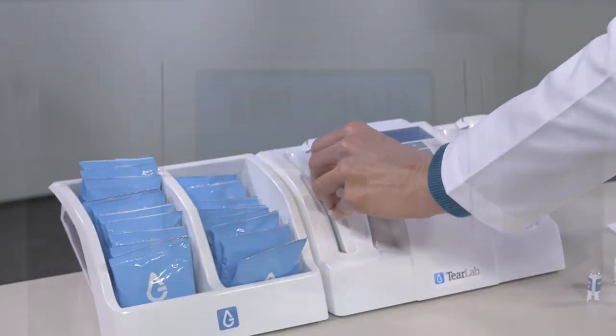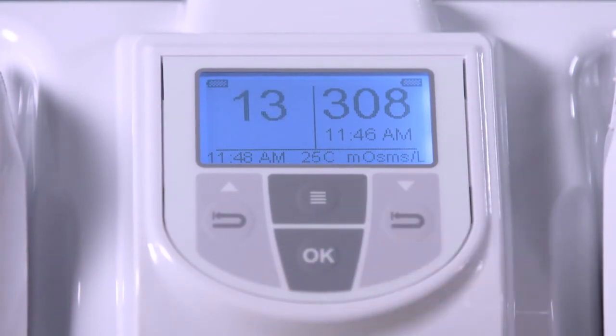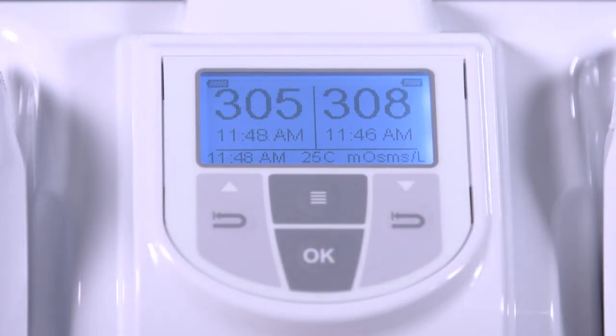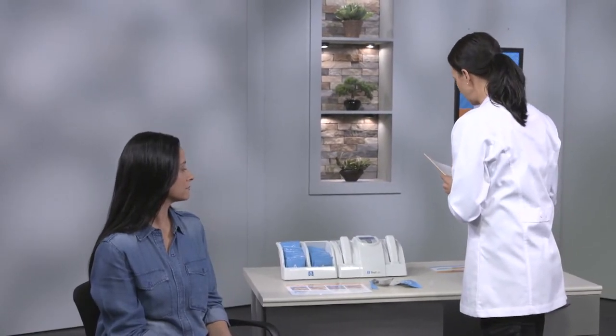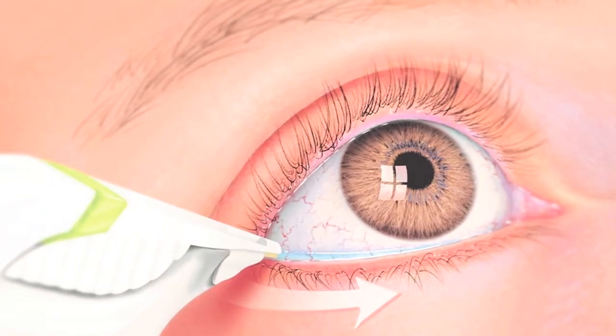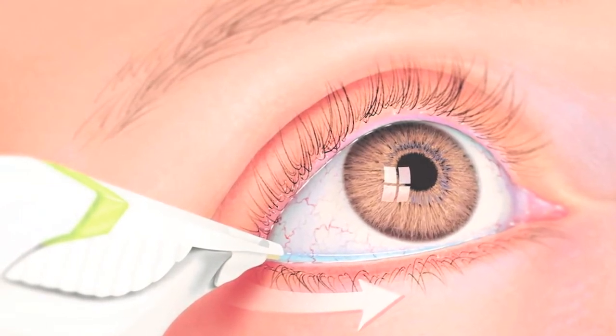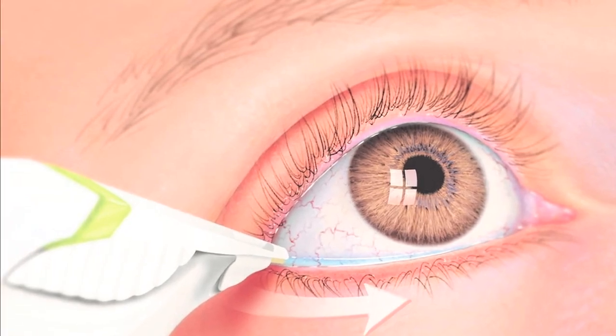Repeat the procedure on the other eye with a new test card. If tears are not collected immediately, do not pull the pen away from the eye. Leaving the test card in contact with the eyelid, lightly brush the pen back and forth along the outer one-third of the lid, avoiding the cornea.